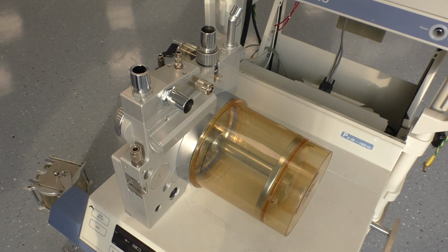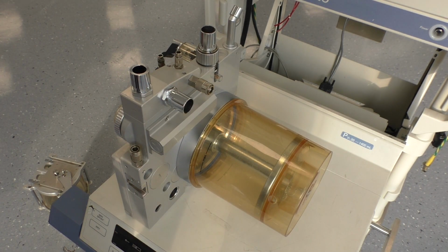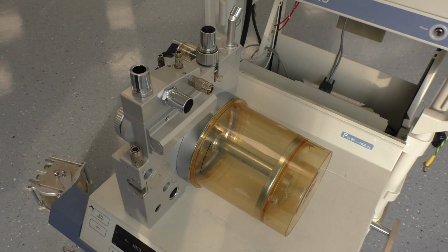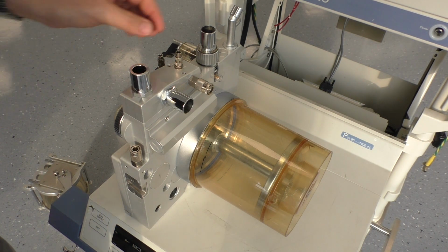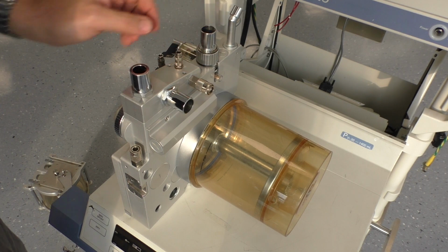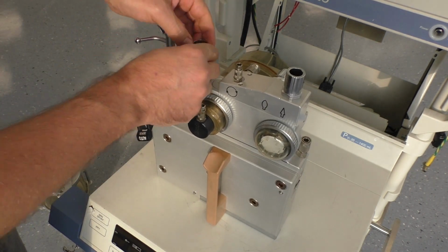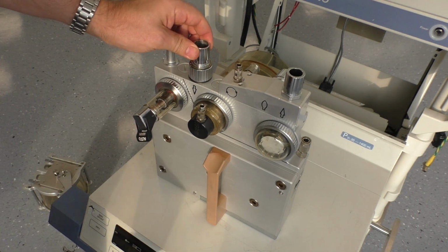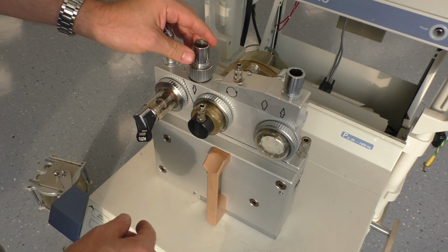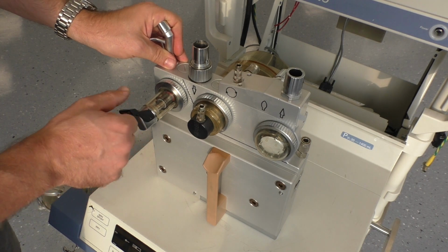So this container is normally filled up to here with lime or magnesium hydroxide or chalk. Don't know how you say it. It's for the absorption of carbon dioxide that comes from the patient through the hose that is connected here. That's the hose that goes out to the patient, where he breathes the mixture of gases here.